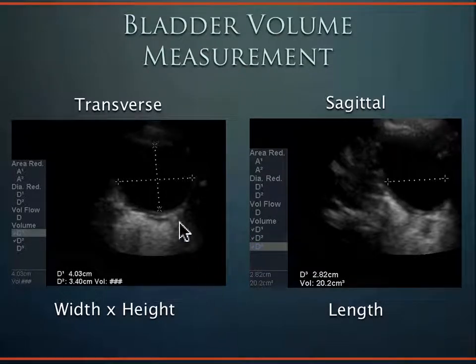height times length. And here's a situation in a transverse plane, so this is to the patient's right, this is to the patient's left. We measure the width using our calipers, and then pop that number into our iPhone calculator, or whatever calculator you have. Then you take the height, so here's anterior, here's posterior, and then you get those two values, and then you unfreeze the machine, and then you rotate the probe into a sagittal plane.